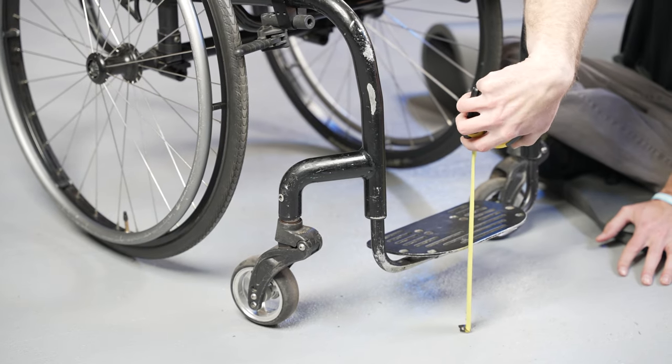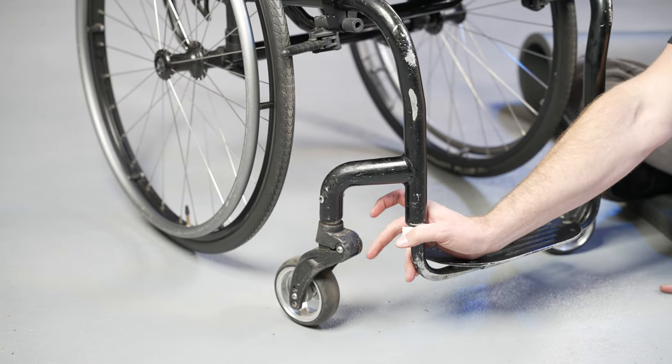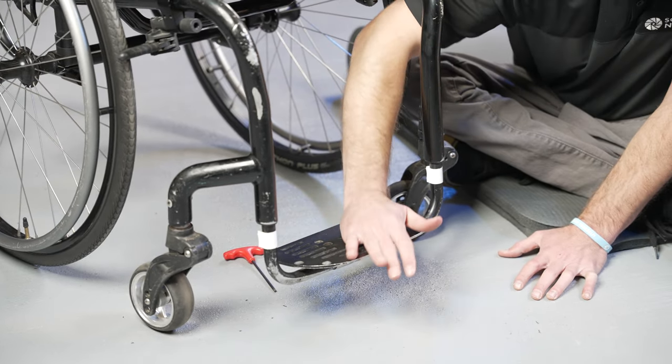Before you loosen any bolts, measure the distance from the ground to the bottom of the footplate and put a mark or a piece of tape to gauge where you started. In order to raise or lower the footplate, loosen the bolt on both sides and gently slide the footplate to the desired position.